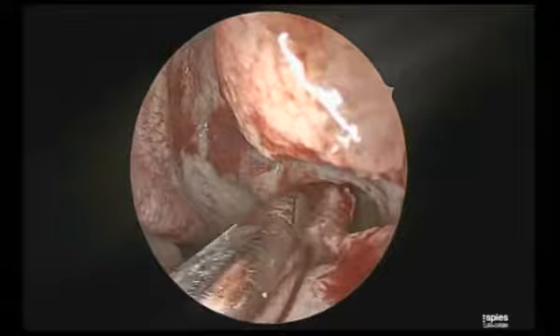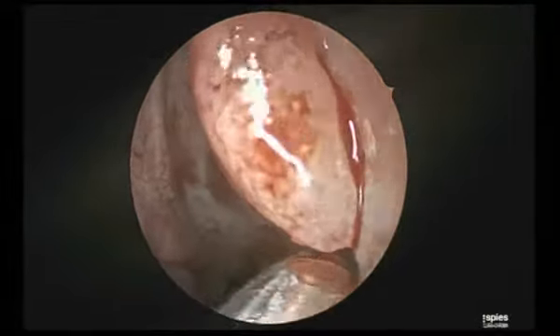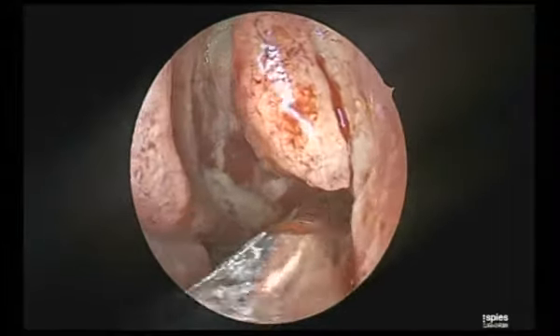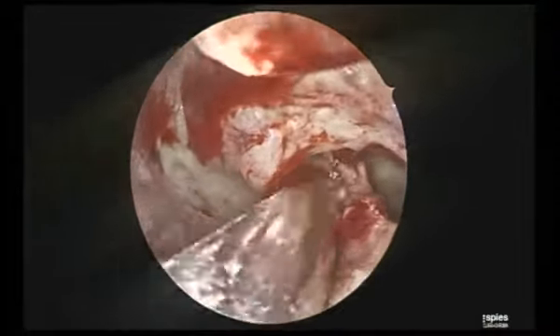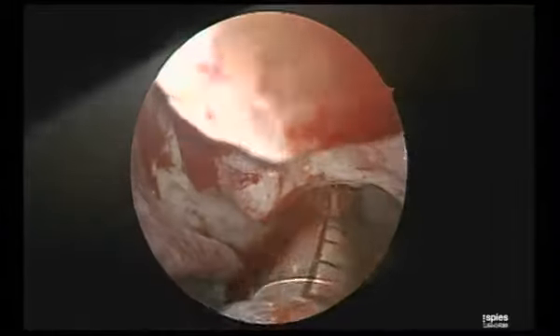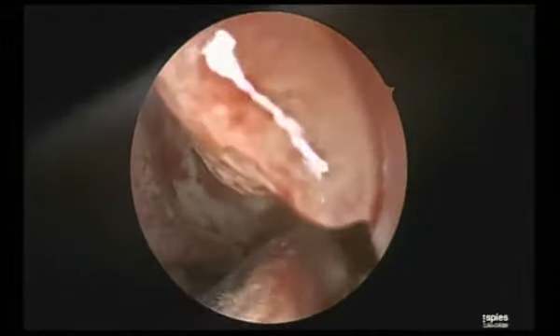My technique is not to fall into all this difficulty, and I can debride this uncinate, or I can bite through this uncinate. The instrument I like in my practice, and the same thing I am doing, is the microdebrider. Got my point? So you can remove the medial mucosa, remove the uncinate, and evert the lateral mucosa. There is no harm in doing that. But believe me, there is no need. It does not influence the outcome.